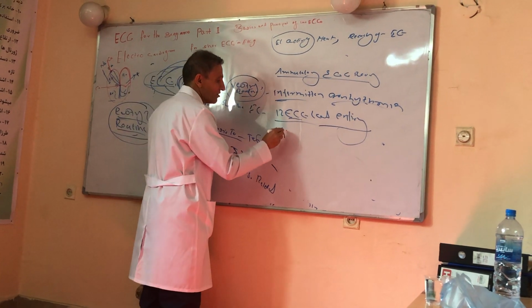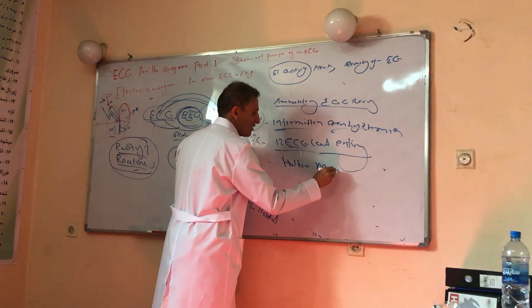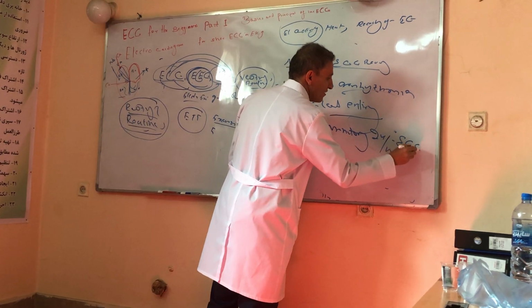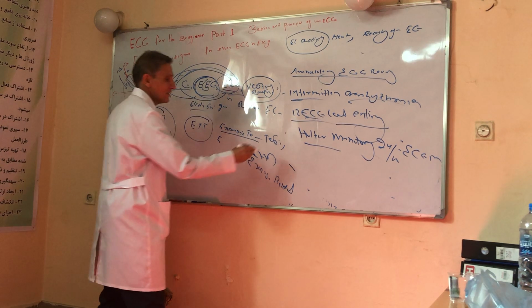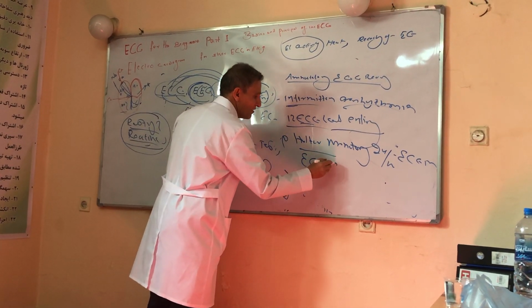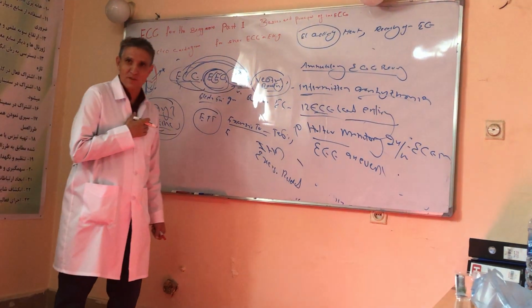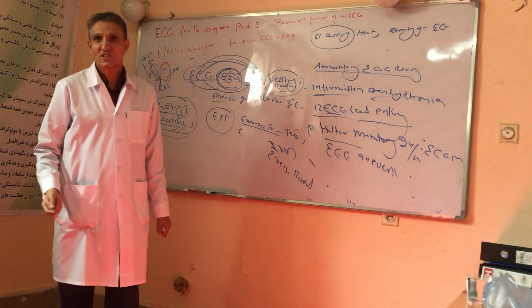One of them is called Holter monitoring, or 24 hour ECG monitor. This was number 1. Number 2, ECG on event. For example, you have intermittent arrhythmia and they check a 12 lead ECG, which is normal.